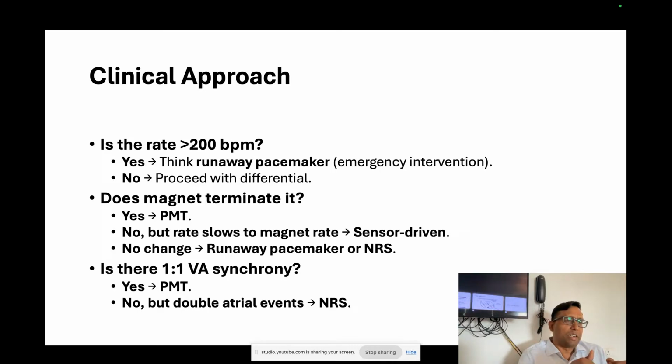It is like giving adenosine. You have just turned off the sensor, because the tachycardia was initiated by the VPC. It has just been sensed and it is just making the circuit. So like adenosine in PSVT, one beat of termination is enough for the magnet. Just once, asynchronous pacing is needed. After that, everything is open.